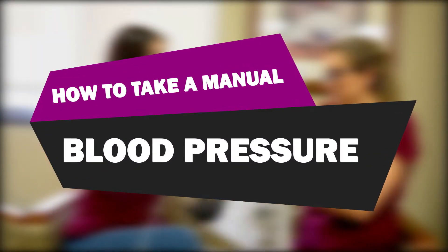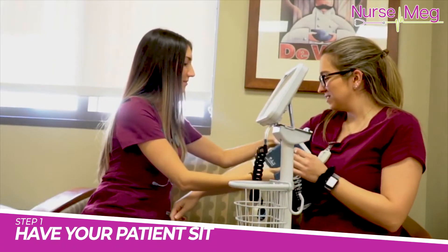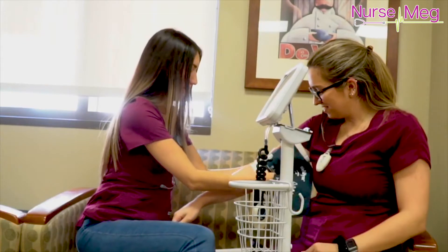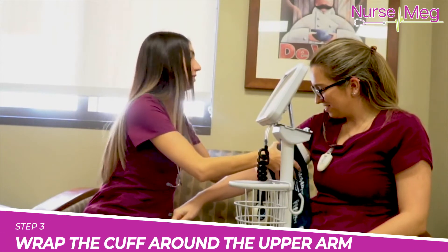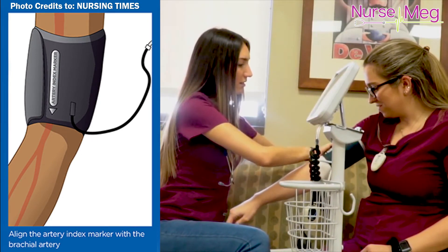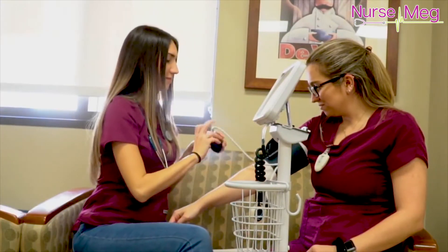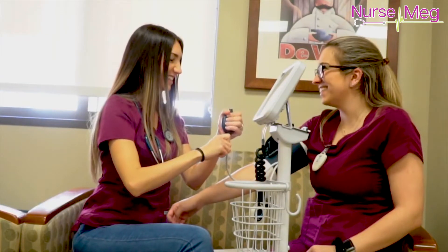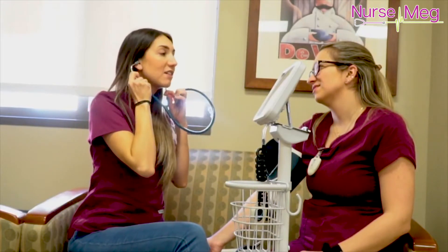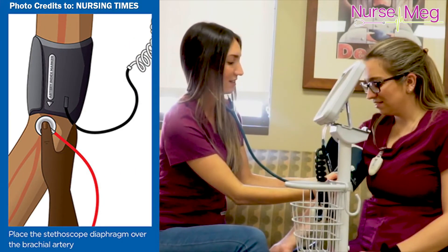How to take a manual blood pressure. First, have your patient sitting or sitting up in the bed. Have them rest their arm down. Start with a cuff that is the appropriate size for their upper arm. Wrap the cuff around their upper arm with the cuff's lower edge about one inch above the antecubital fossa, which is where the elbow bends. After you make sure it's in the appropriate position and not upside down, the bulb and the tubes should be facing down towards their wrist. Lightly press the stethoscope's bell over the brachial artery, which is going to be right below the cuff's edge if you placed it properly.